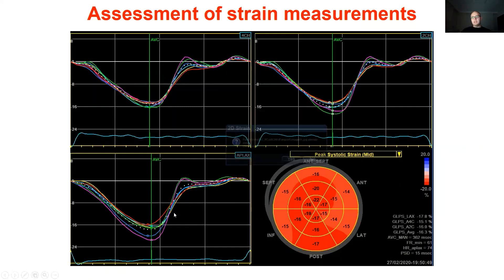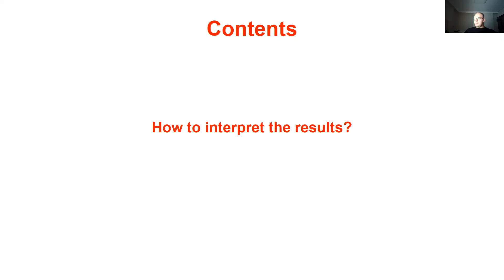After completing all the steps, the software provides strain traces from each apical view and the bullseye plot. Here you can see strain traces of each segment. Usually an 18-segment model is used and the bullseye plot is given, allowing you to document the entire left ventricular deformation in a single plot. The average GLS is also reported. The bullseye plot or strain traces can be changed to show any deformation parameter supported by the vendor.